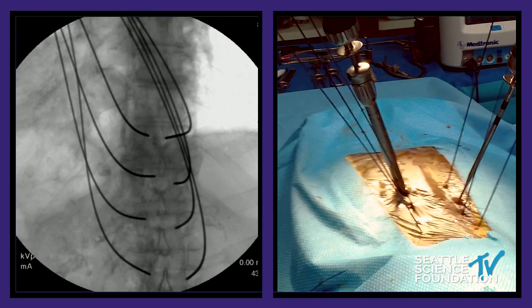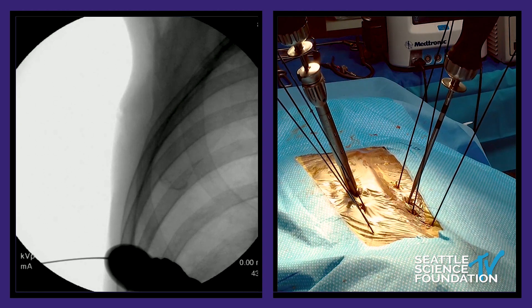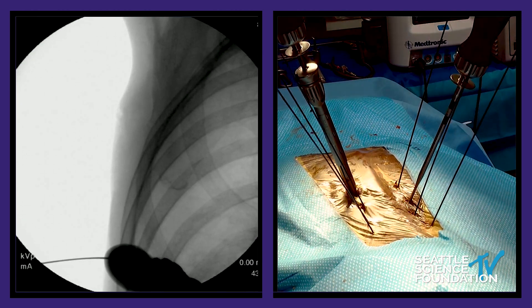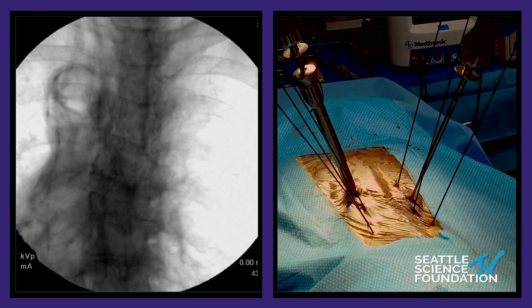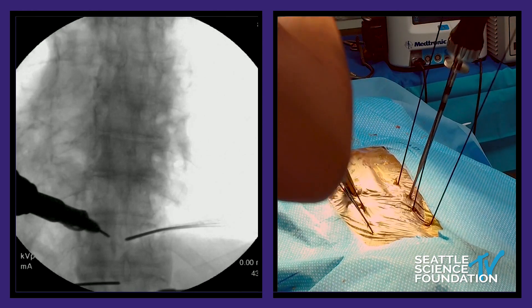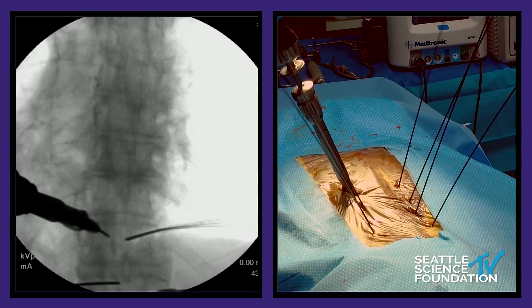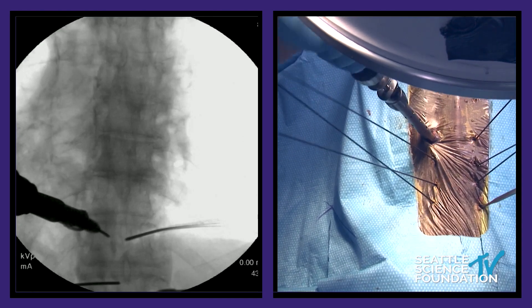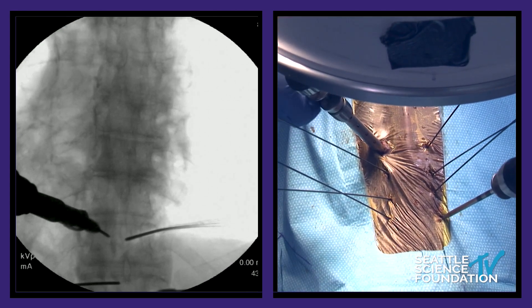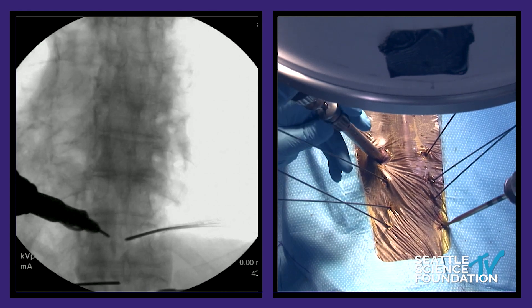Let's get a shot there. Go towards you, Victor — keep going towards you, come south a little bit more. Right there, let's get a shot. You can see that screw going into the pedicle. Just for the sake of time we're not going to put in all these screws since we're running late, but essentially what I do is line them all in, and then at the end we put the rod on, and then at the very end we put our caps on and reduce the rod.